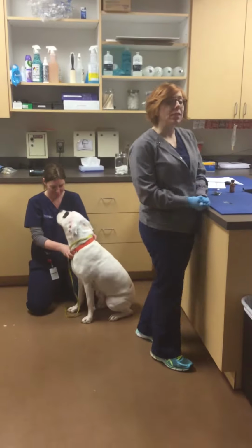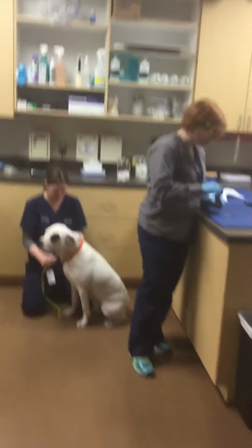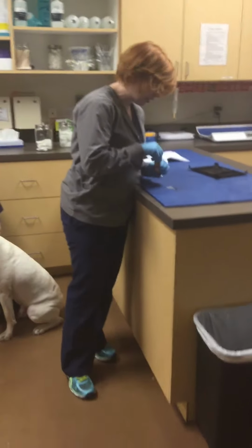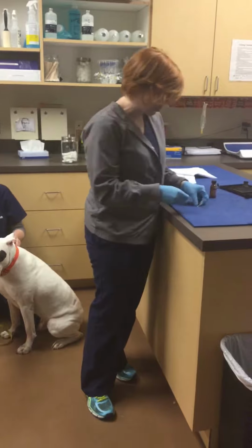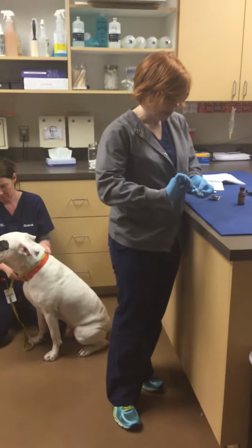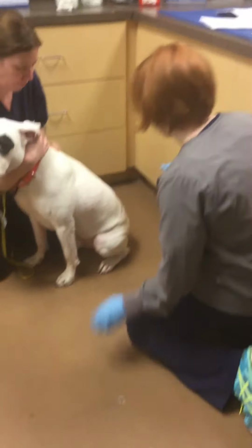This is Ashley Anderson's Task 14 doing a skin scrape. So I'm going to place a drop of mineral oil on the microscope slide. And then I'm going to take a new scalpel blade and I'm going to soak it on both sides like this. So the site I have right here is this area we clipped here.